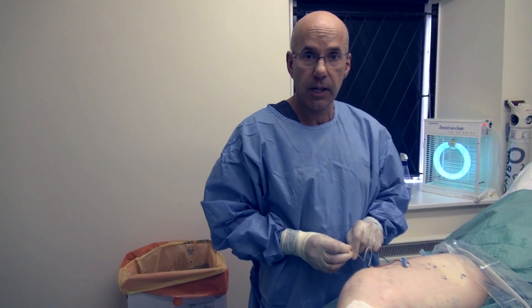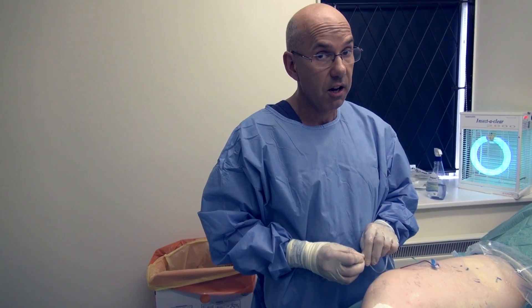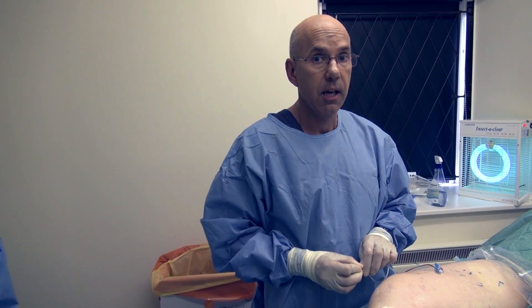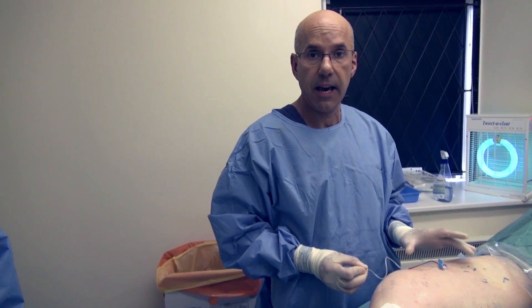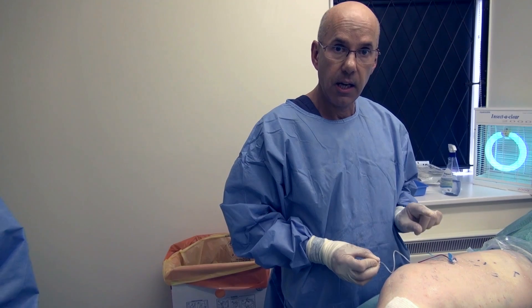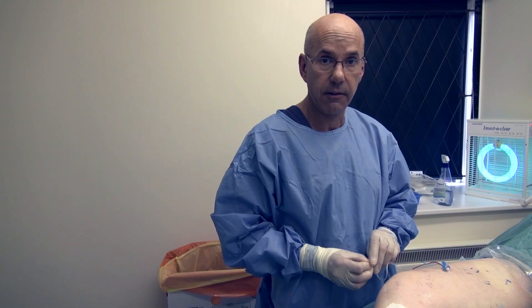I don't wish to cause Carol any alarm, but in the event that an artery was cannulated and injected, the consequences could be disastrous. So I'm very careful — we use a cannula and we have those 3 strict criteria to confirm before we do any injections of foam sclerotherapy.